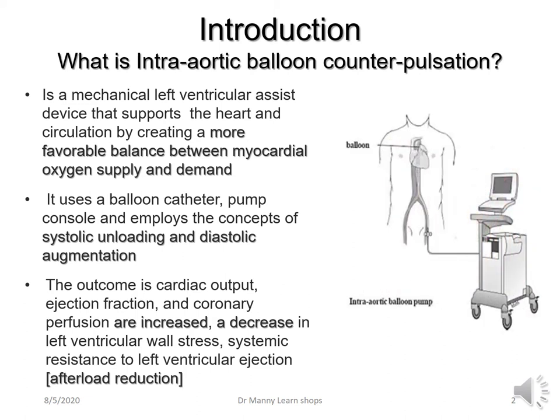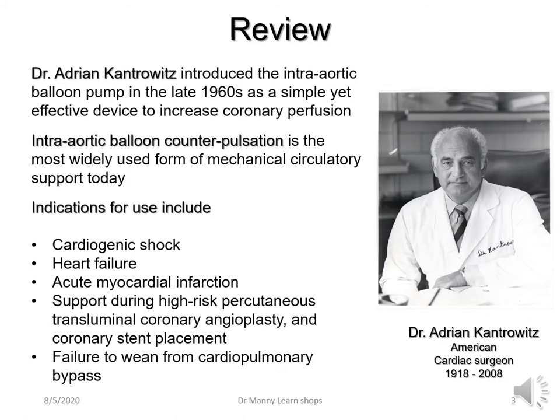It consists of a balloon catheter, which is implanted in the descending aorta and uses an intra-aortic balloon console or pump. The founder and creator, an American cardiac surgeon, Dr. Adrian Kantrowitz, introduced the IABP, or the intra-aortic balloon pump, in the late 1960s as a simple yet effective device to increase coronary perfusion.